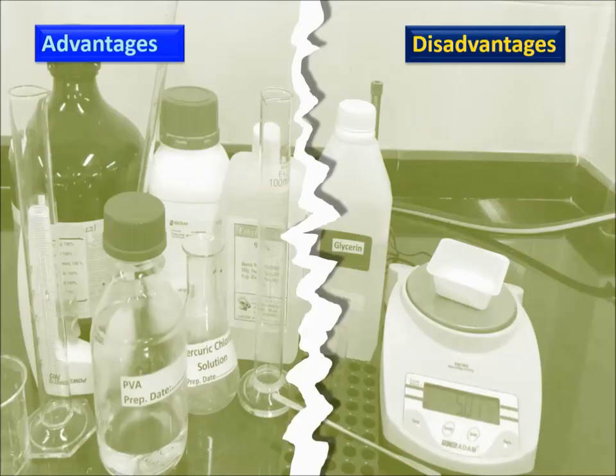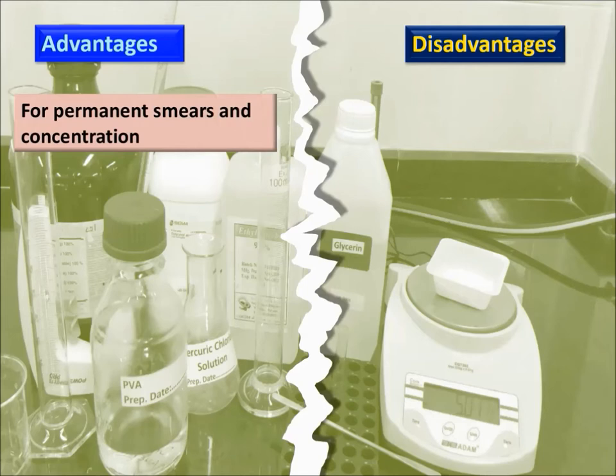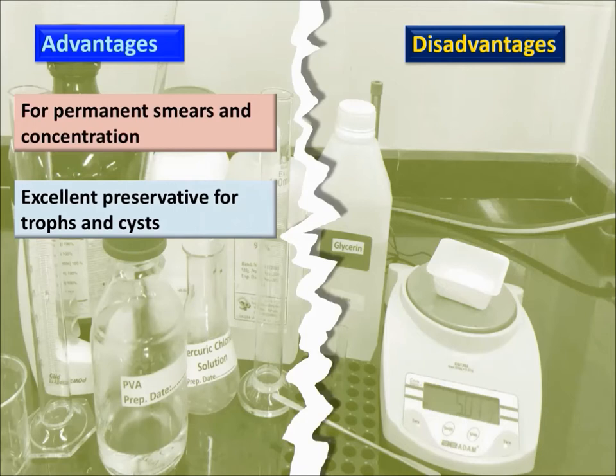Advantages: suitable for permanent smears and concentration; excellent preservative for trophozoites and cysts; long shelf life; suitable for shipping samples.